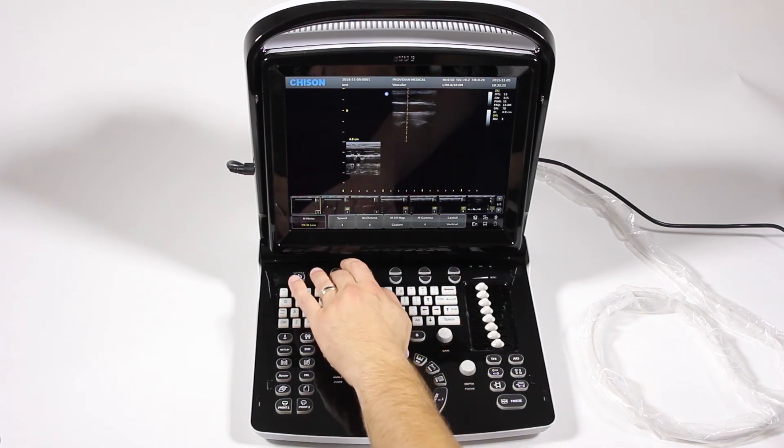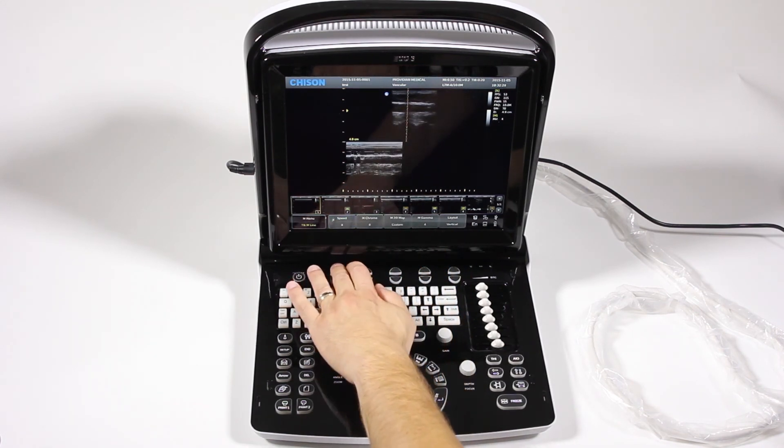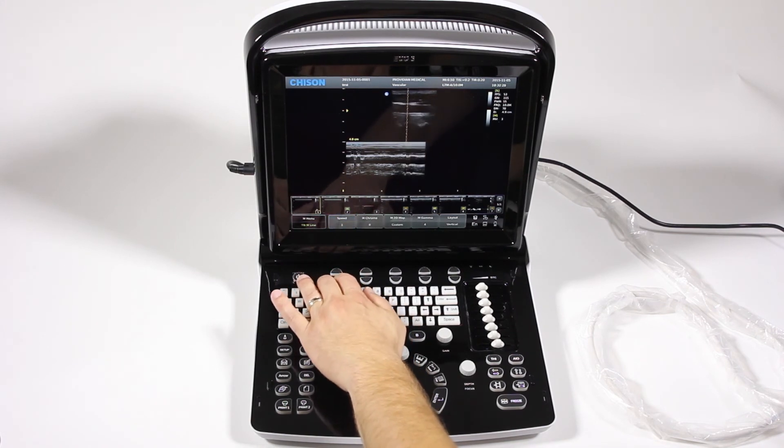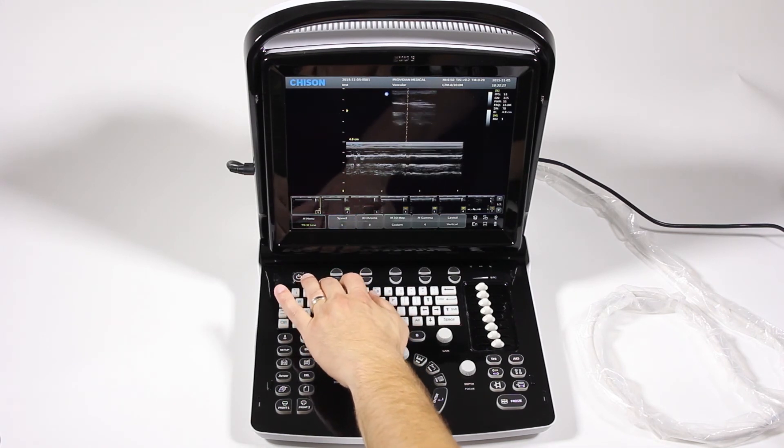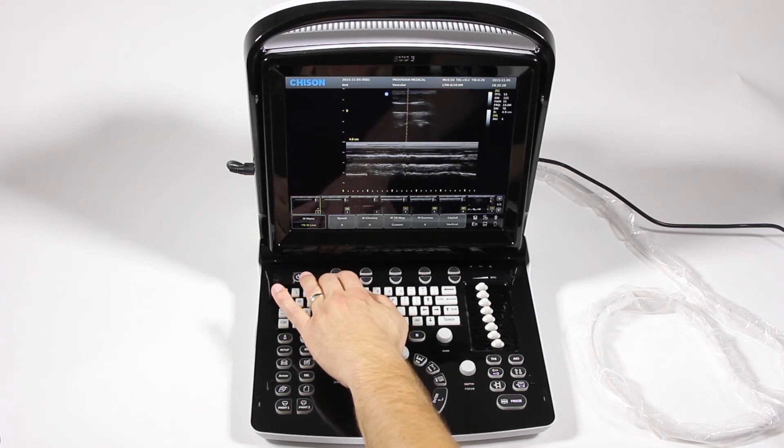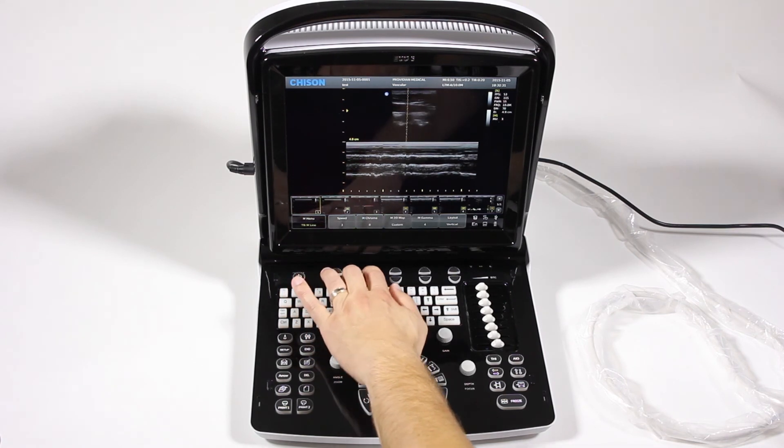Change your speed down here. Oddly, the lower numbers show a higher speed, and the higher numbers show a lower speed. Your chroma map to change the color.